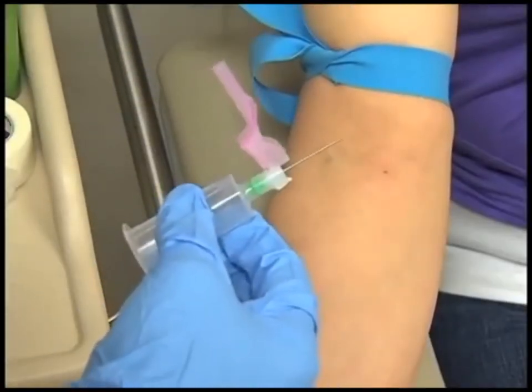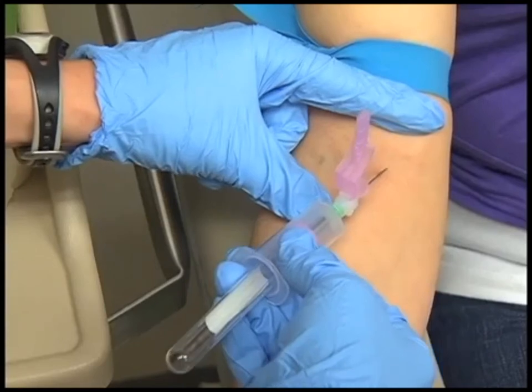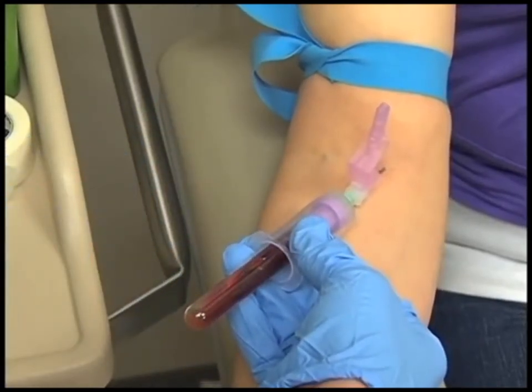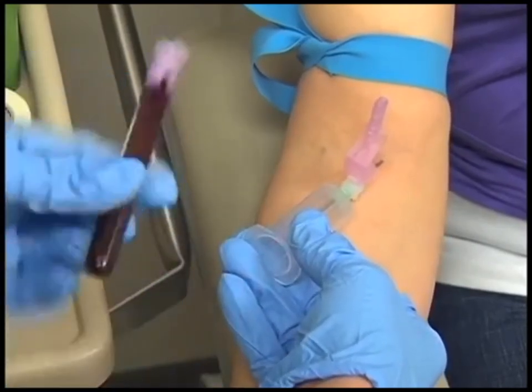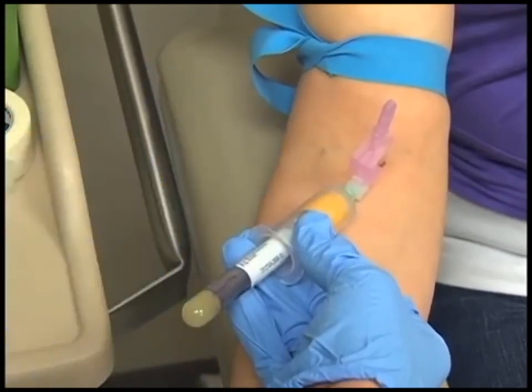Anchor the vein. Inspect your needle. Position the needle at a 15 degree angle to the arm and rest the backs of the fingers on the patient's forearm. Ensure that the needle points in the same direction as the vein to be entered, with the bevel of the needle pointed up. Tell the patient that he or she will feel a small stick, and with one continuous steady motion enter the skin and then the vein. You may feel a sensation of resistance followed by a release as the vein is entered. When the release is felt, you have entered the vein and should not advance the needle any further.